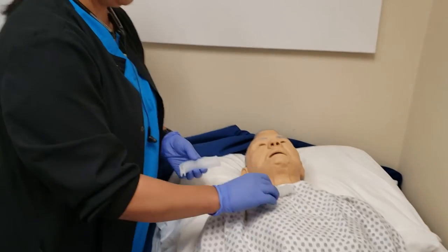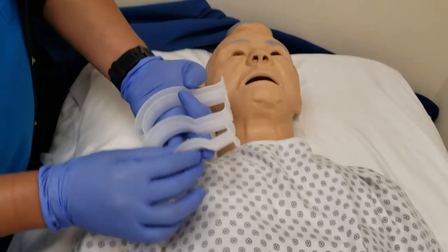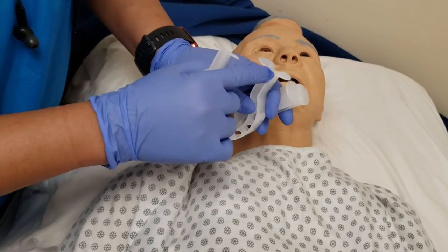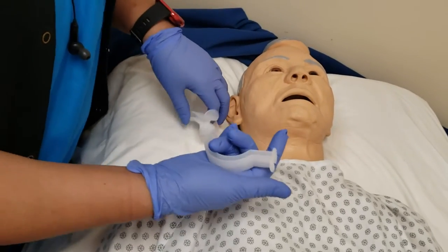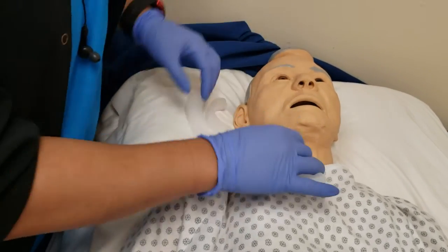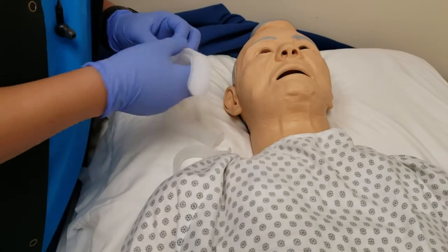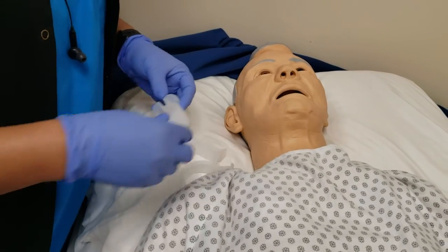Same thing with the NPAs — you have different sizes. On some of these, if you look inside you're not going to be able to see it, but the sizes are on the side. This one's a size 5, and these others I'm not sure because they don't have the size on them. We're also going to measure — same thing with the NPAs — you don't want to put an OPA that is not quite right for the patient.